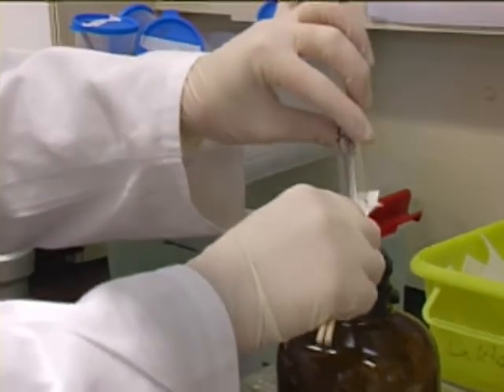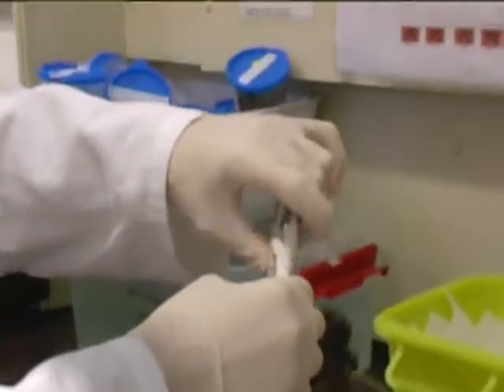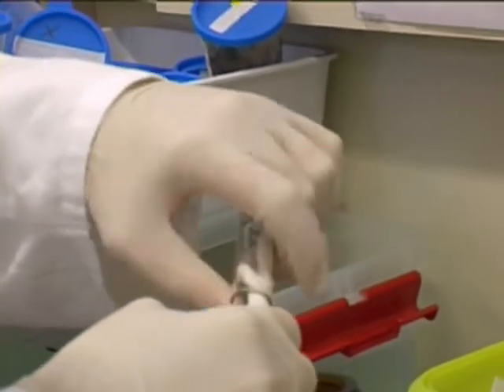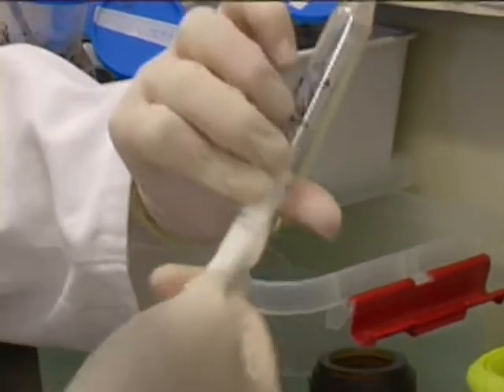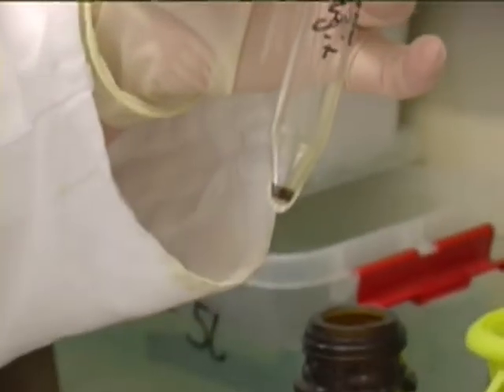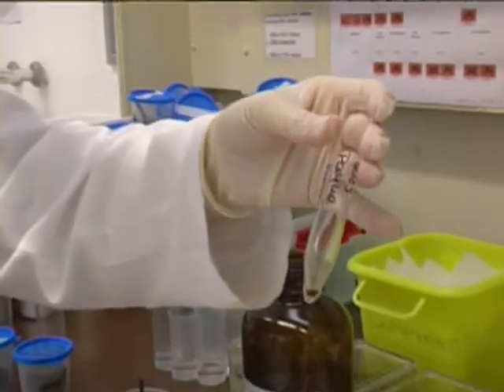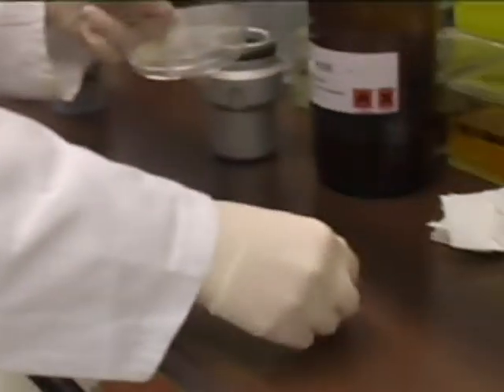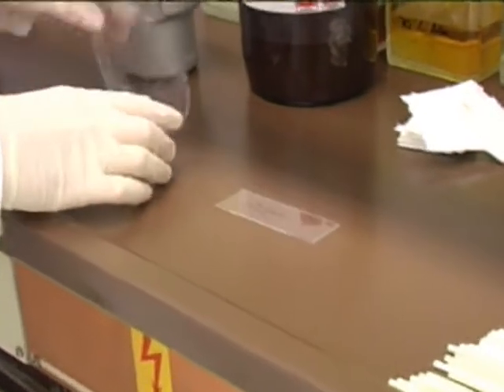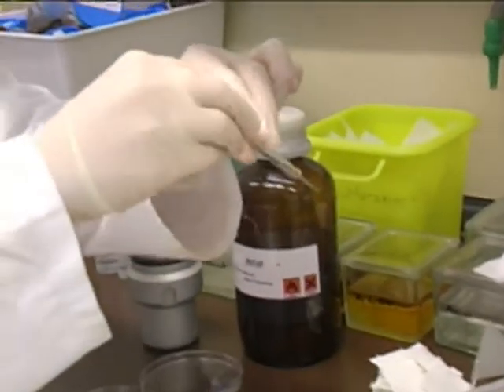Let it flow out. Make it clean. You clean everything except for the sediment, so you leave the sediment in. Then it's ready. You can mix it up. Now it comes to the slide. With a glass pipette, a Pasteur pipette.